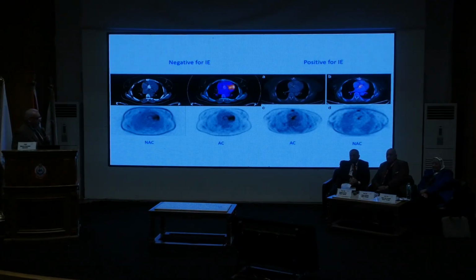This is a case of a negative, and this is a positive case. We have seen this diffuse uptake before, and the study was negative with patients without infective endocarditis, and here we have focal and localized uptake. So this is a positive case for infective endocarditis.